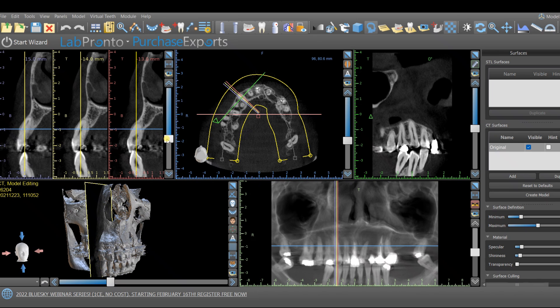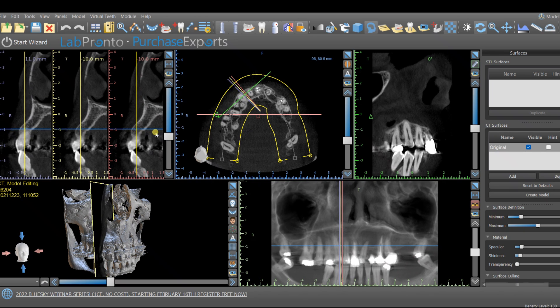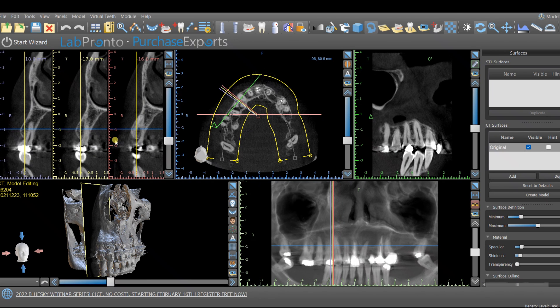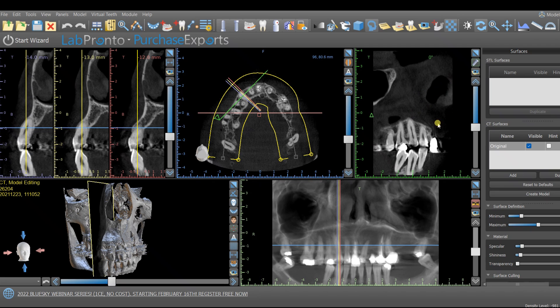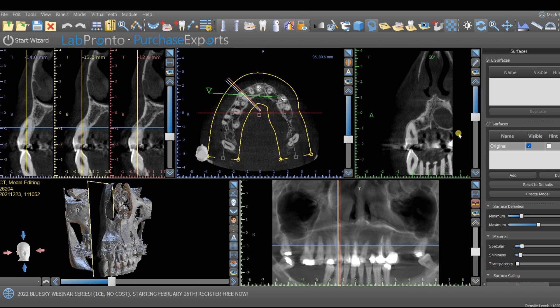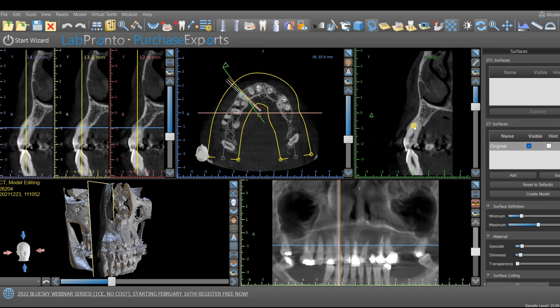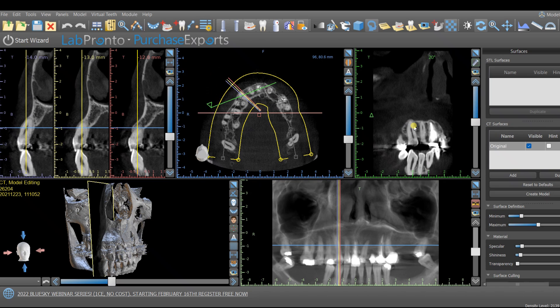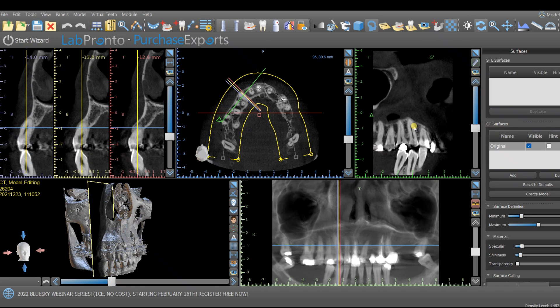Now you can understand how the cross-section view is working. The last view is the tangential view — our 360-degree view. The purpose of this view is to show us 360 degrees around a particular anatomy or around an implant. As we move through those slices, we can see in the axial view that the green indicator is rotating accordingly, rotating around the specific anatomy we are trying to see.